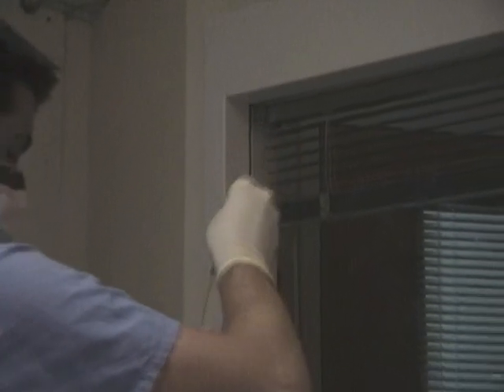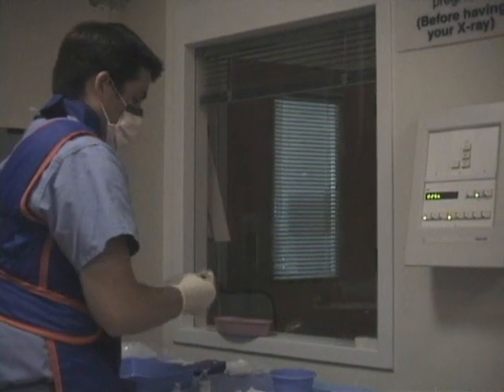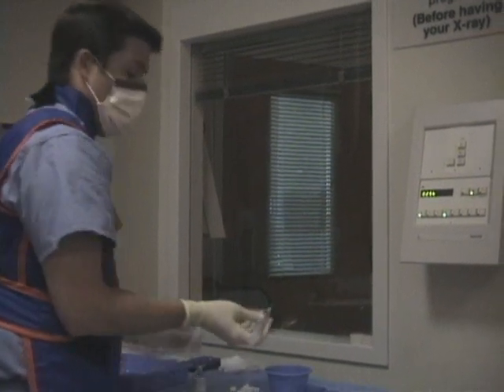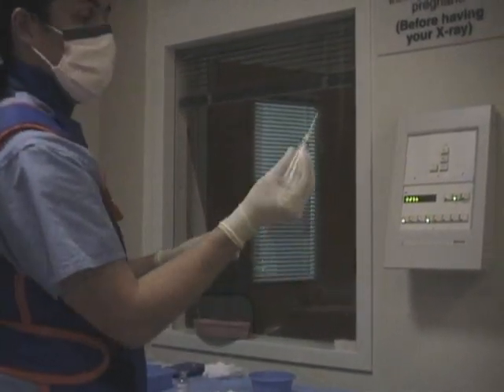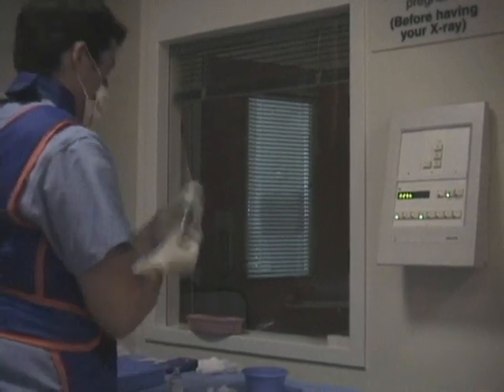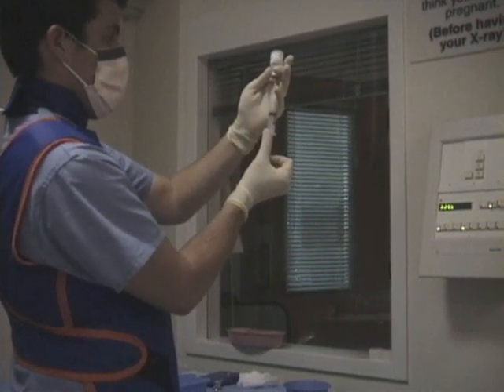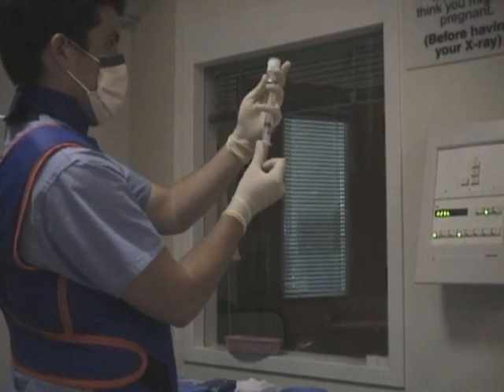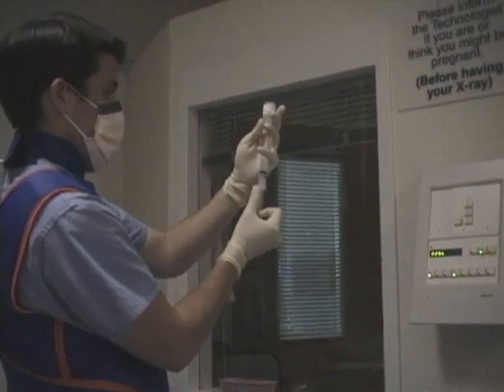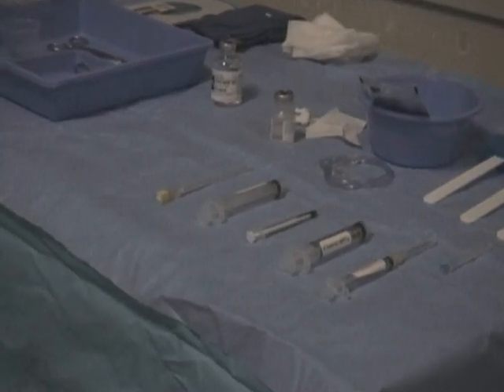Then dilute the 0.1 cc's of Magnivist in the 10 cc saline container, mix vigorously, and then draw back the entire 10 cc diluted mix. Now you have everything set up and you're ready to get started.